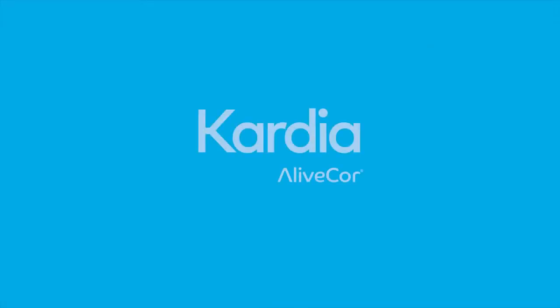Use Kardia with the Kardia app to collect and share important data with your doctor, easily and securely. It's a proactive new approach to heart health and a breakthrough in personal medical technology.